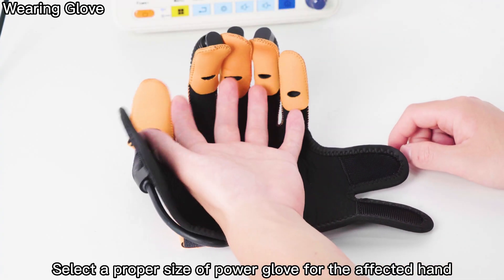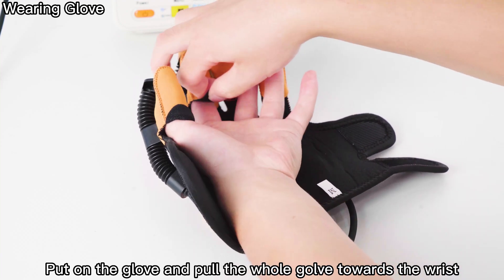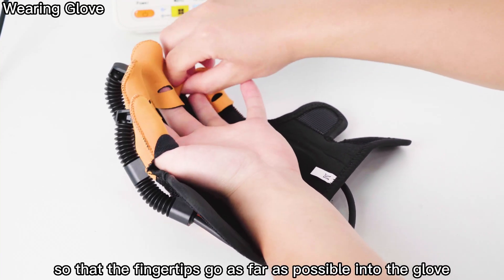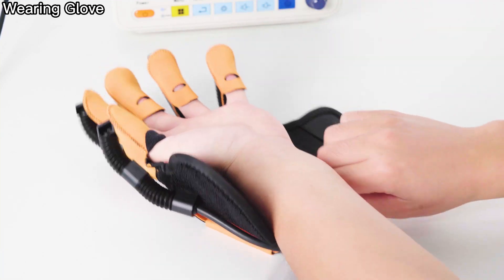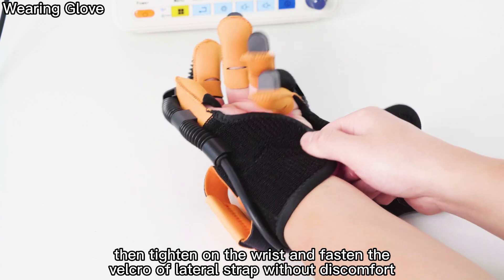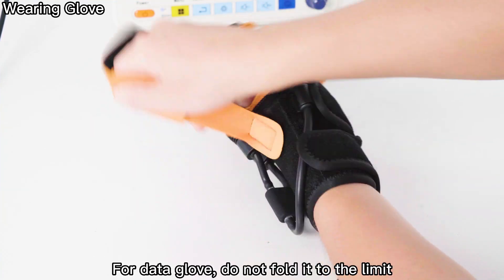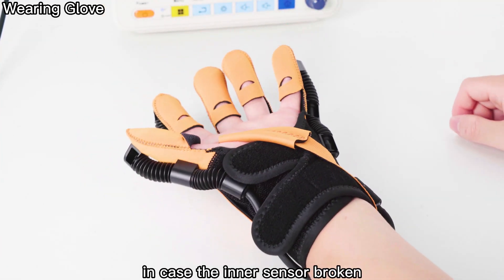Select a proper size of Power Glove for the affected hand. Put on the glove and pull the whole glove towards the wrist so that the fingertips go as far as possible into the glove. Then tighten the wrist and fasten the Velcro of the lateral strap without discomfort. For the Data Glove, do not fold it to the limit, in case the inner sensor is broken.